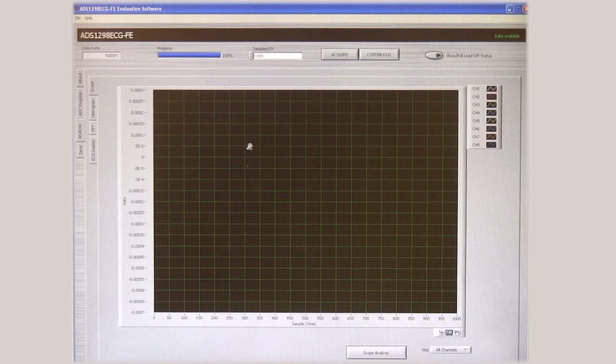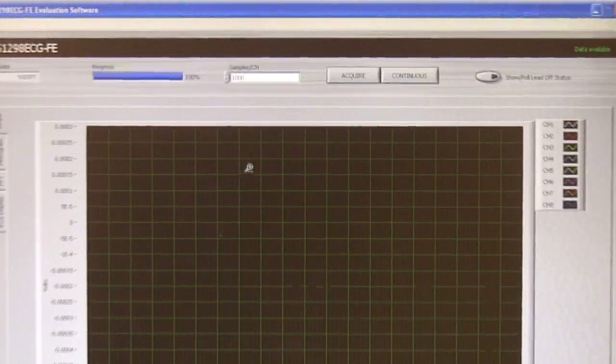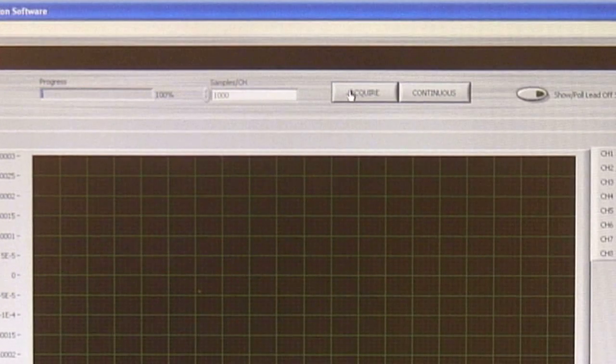Using the provided software all ADS1298 registers can be read from and written to. The device can be evaluated in many different modes and data can be taken and displayed. The software starts up the device with the inputs internally shorted. The extremely low input referred noise of the device can be evaluated in this mode. Just click on the acquire button to acquire data from the interface board.